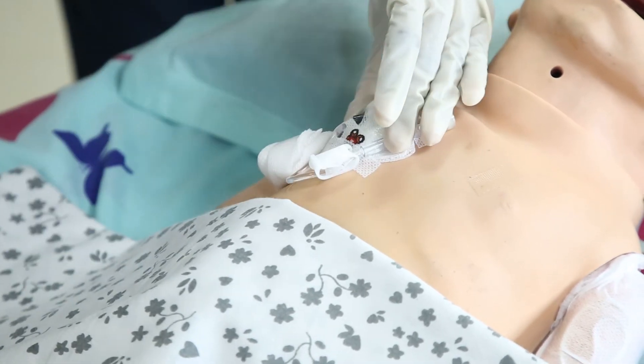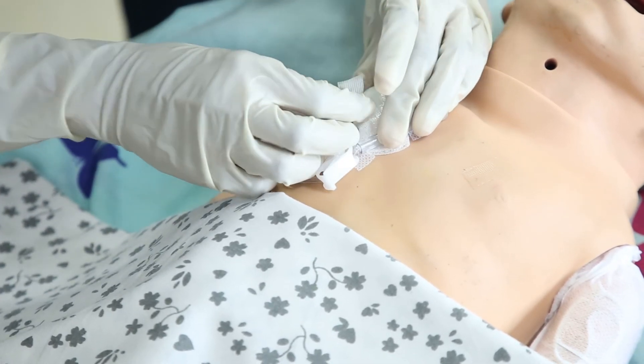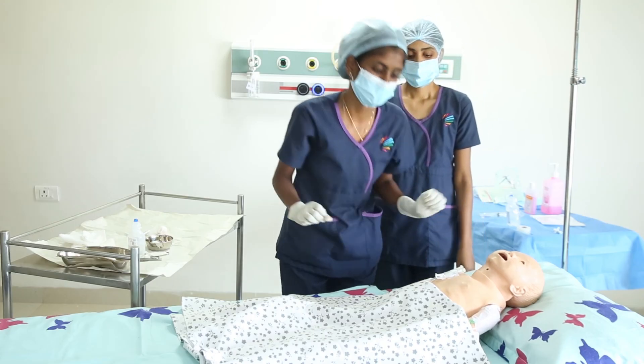The needle should be changed at least once every 7 days, or if there is any difficulty in flushing or inability to obtain blood return. So this concludes the session. Thank you.